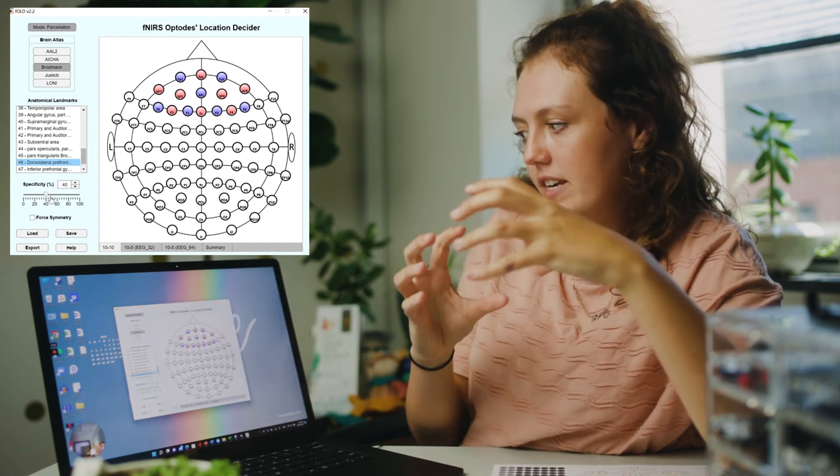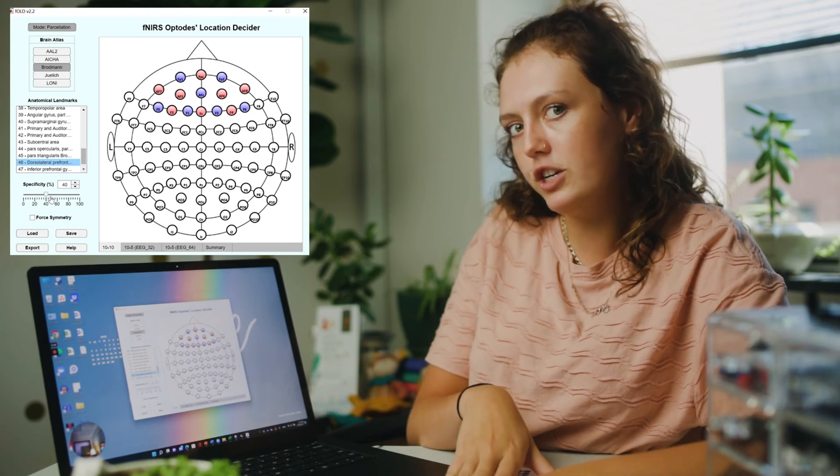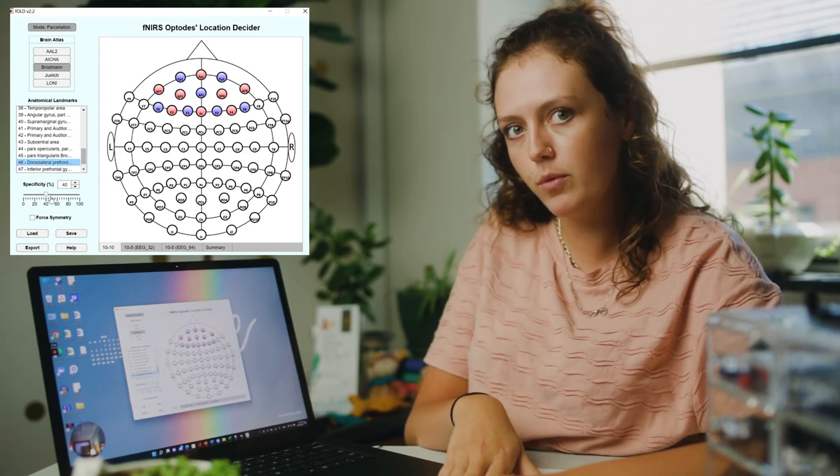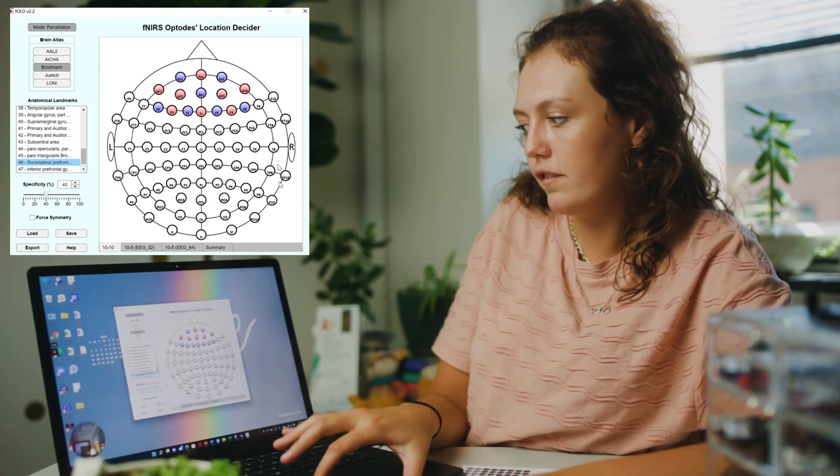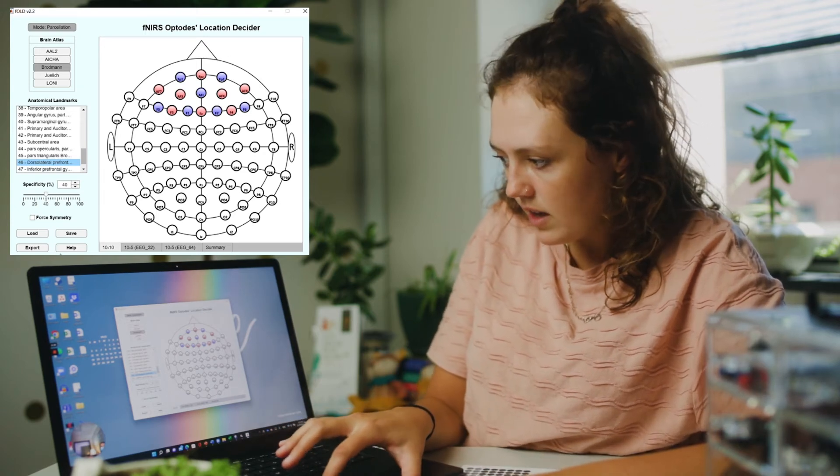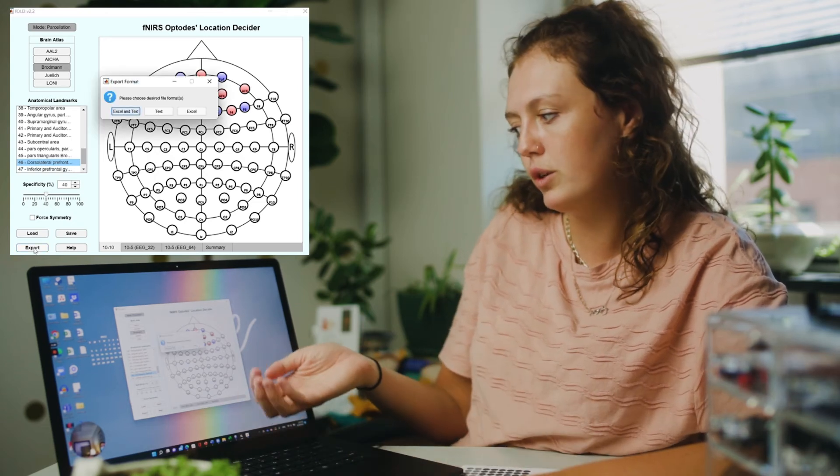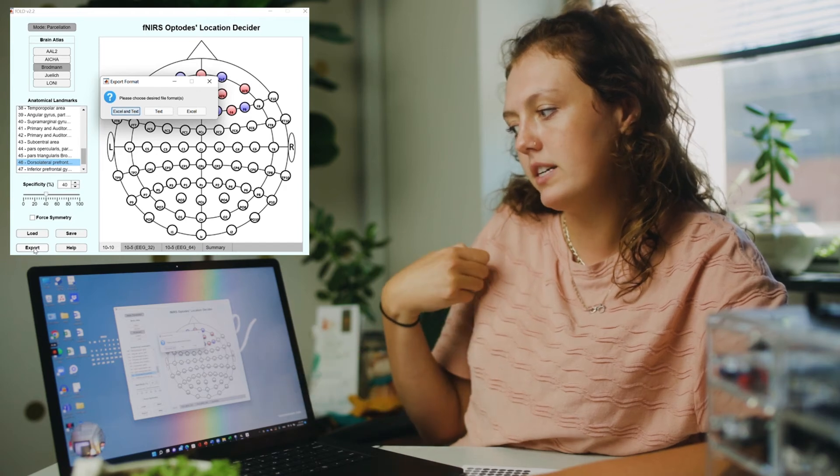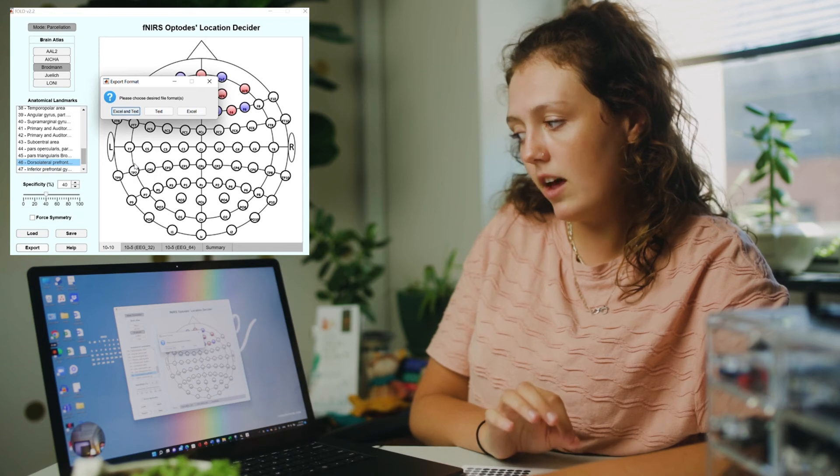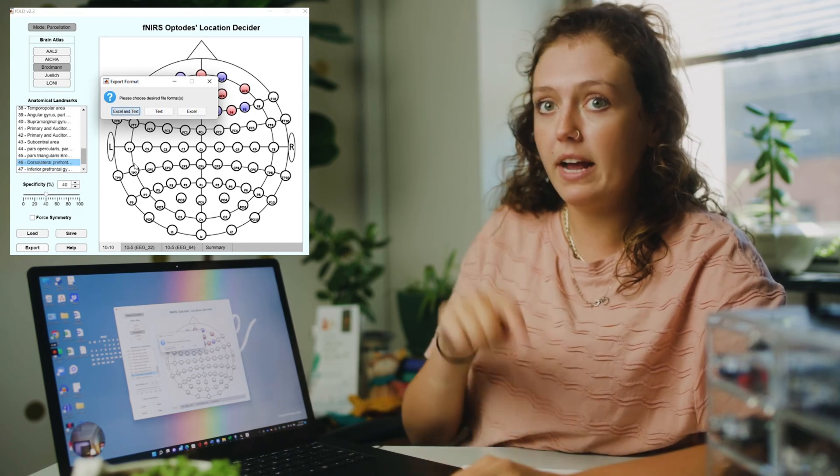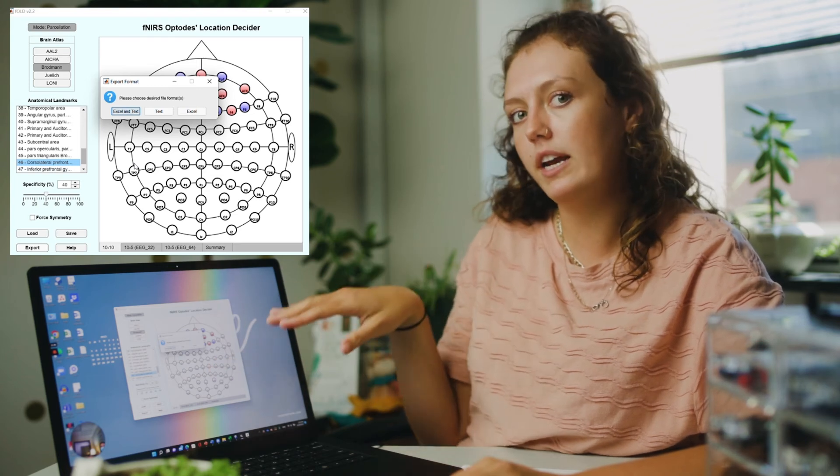So I want to save this because I'm going to use this as a map to then plot my configuration on the Nearsite montage software. I'm going to export it as a text file because in order to upload this to the Nearsite montage, it needs to be saved as a text file. You could also save it as an Excel and it will give you the plot points, and you can manually put it in. But this will allow me to just upload it to Nearsite and it will populate it automatically.